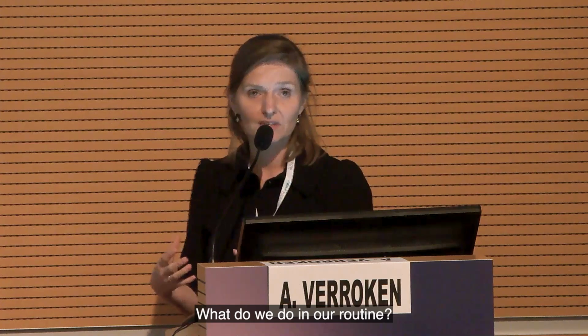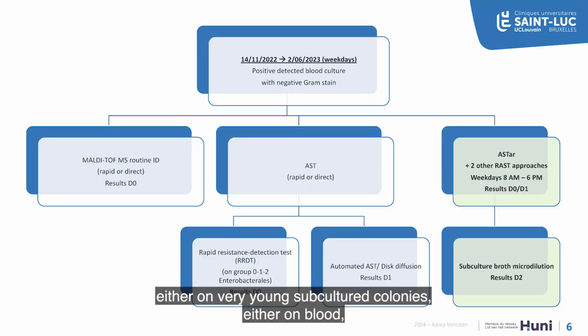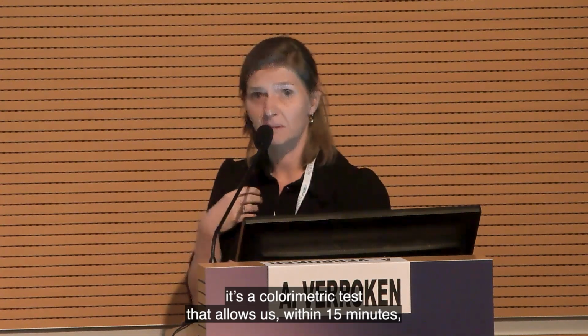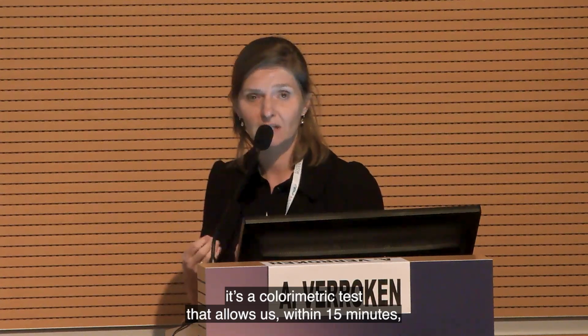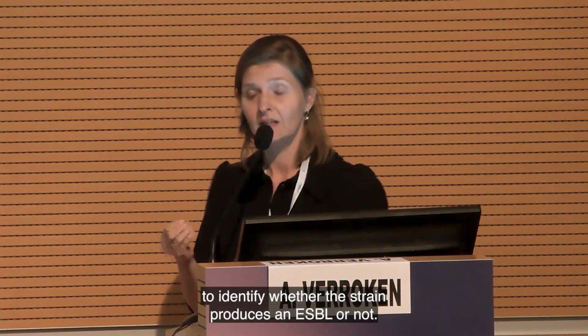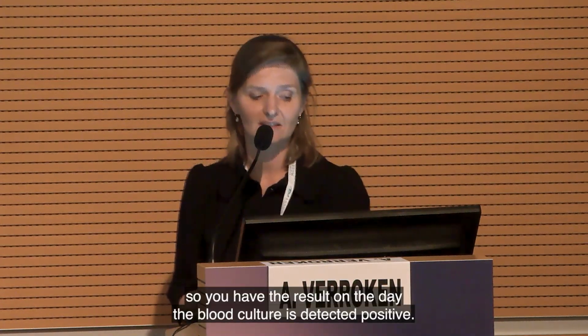What do we do in our routine? For the identification, we do MALDI-TOF, either on very young subcultured colonies or directly on blood, which allows us to have the identification result on the day of positivity detection. Considering AST, we actually have two tests. We have a rapid resistance detection test, a colorimetric test that allows us within 15 minutes to identify whether the strain produces an ESBL or not. That's also done on day 0, so you have the result on the day the blood culture is detected positive.